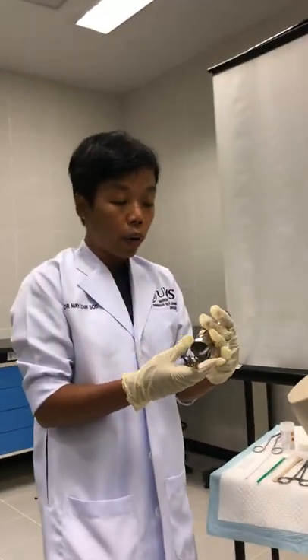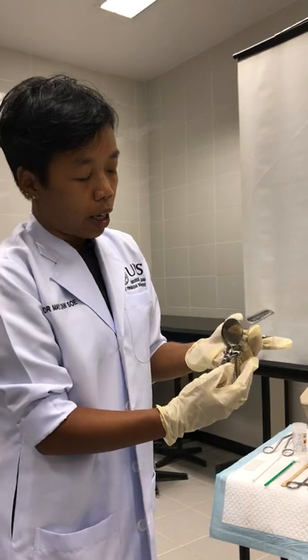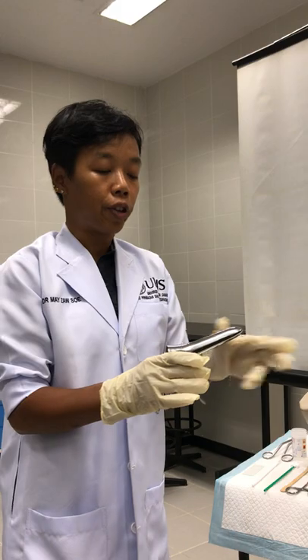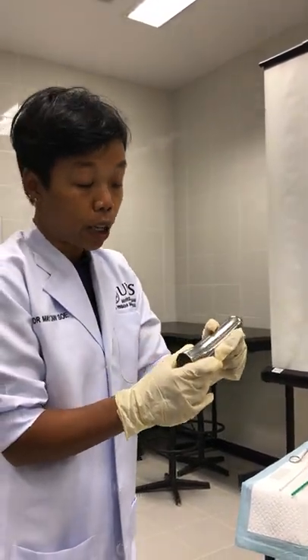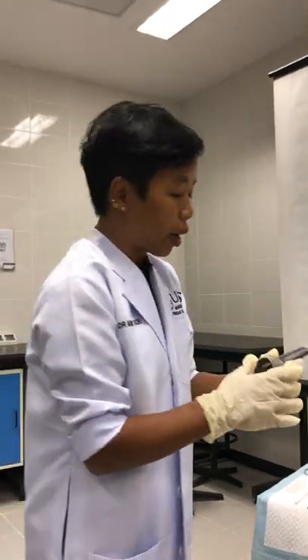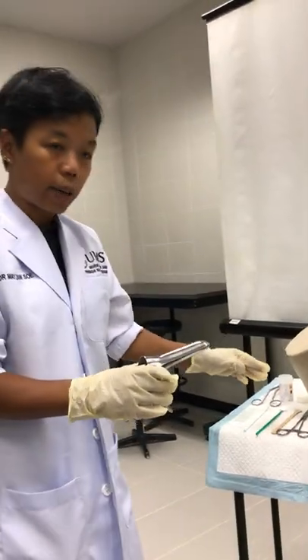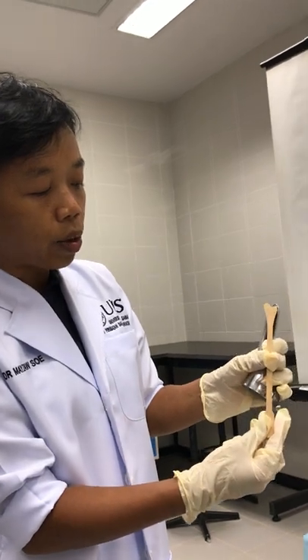First, after everything is ready, you must get the correct speculum — the correct color and size. This is the Cusco's bivalve vaginal speculum. You have to make sure the instrument is well-fashioned before you put it into the patient's vagina. It has to be warm, not cold, and lubricated with warm water.